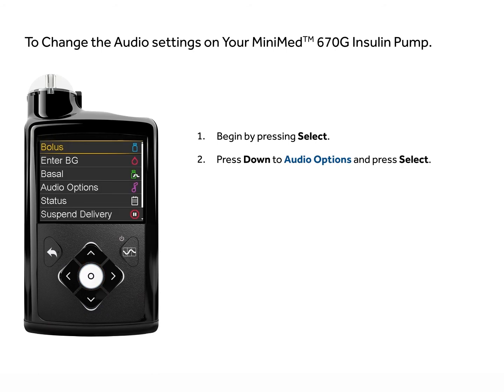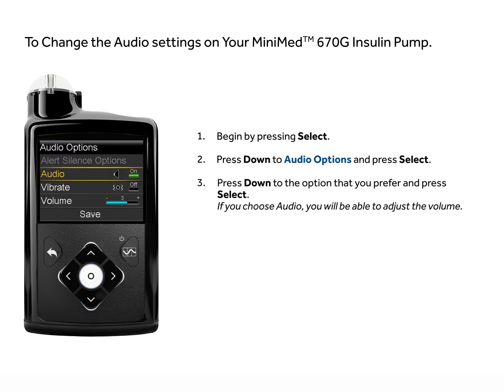Press down to Audio Options and press Select. Press down to the option you prefer and press Select.